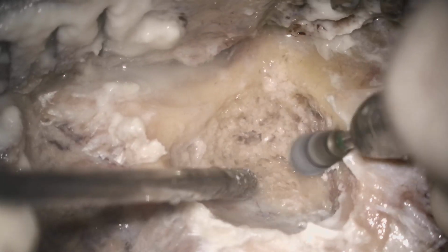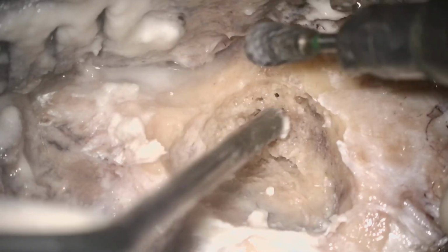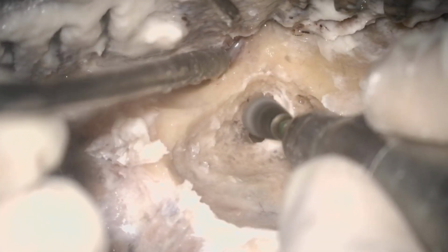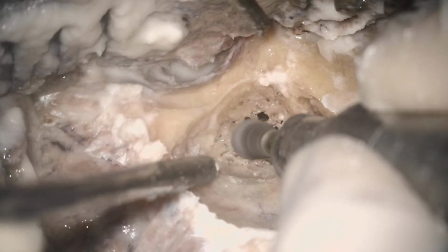And like this is the drilling, this is the sound, and this is the sound. Between the two sounds you have some difference, and this difference will tell you the important landmark. When hollow structures are very close, at that time you can minimize the speed of the bur, you can change the rotation speed of the bur, you can change the size of the bur, so that you can minimize the damage. And one more thing, we always delineate superiorly the tegmen, posteriorly the sigmoid sinus, but we always fail to delineate the canal wall, and that is very important for further work.